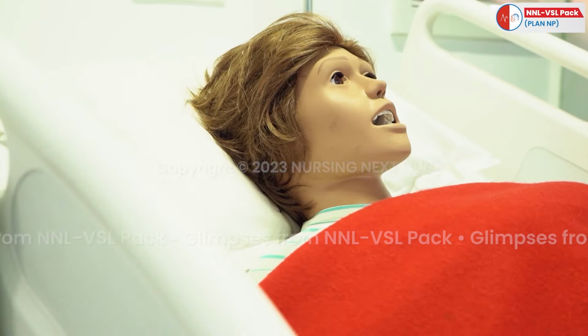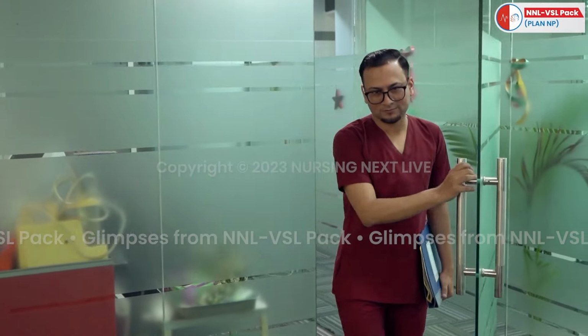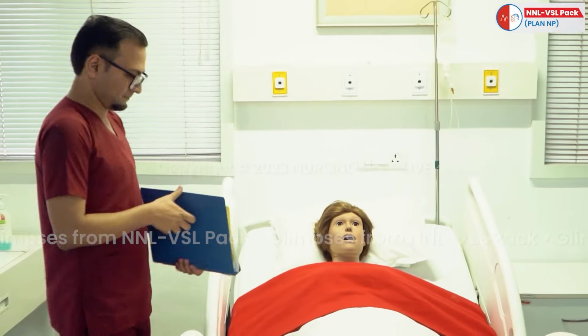Let's see the steps of procedure of male catheter care. Enter the patient room. Perform hand hygiene.